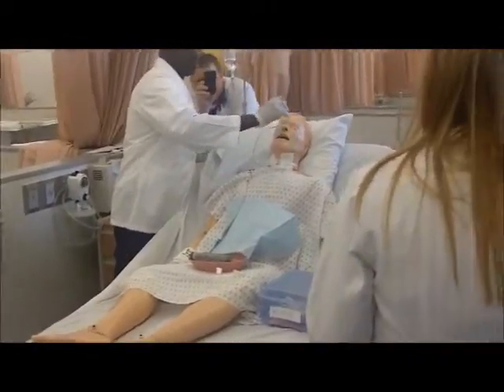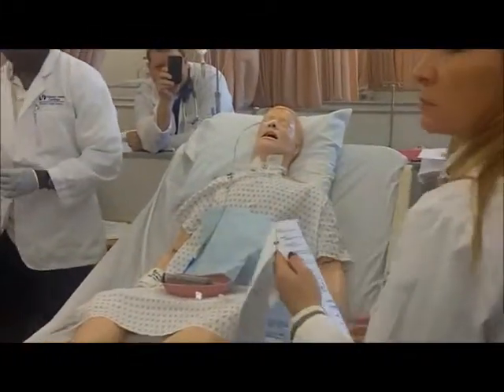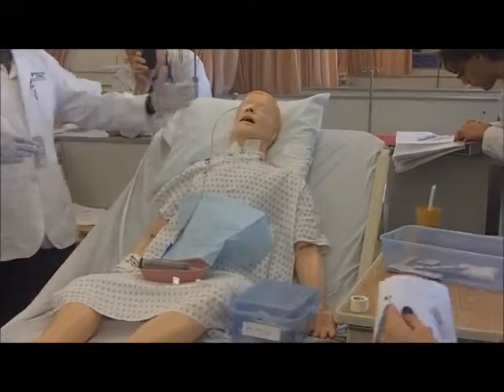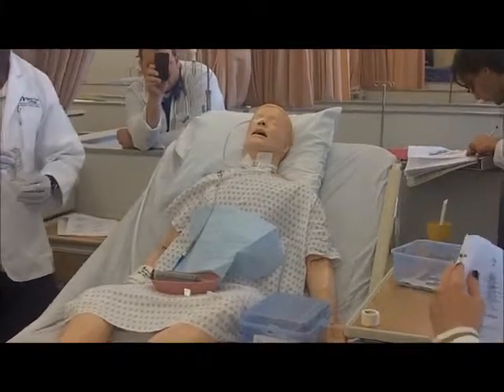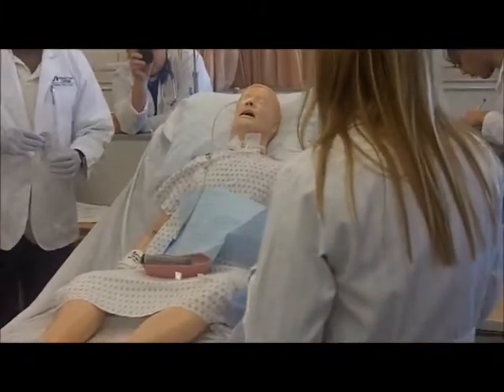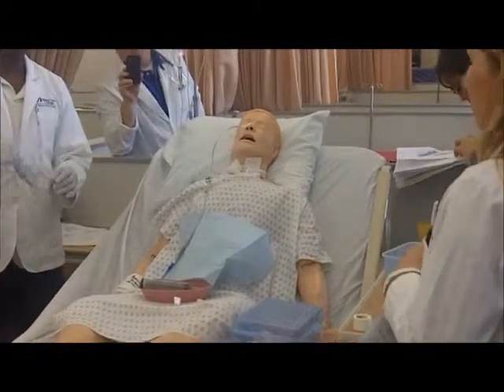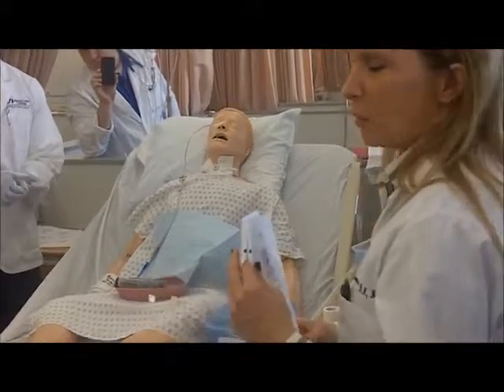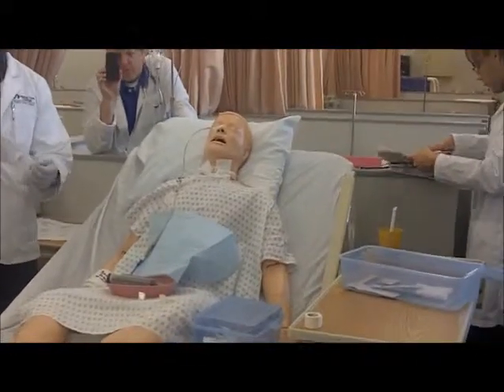Side rail back up, and bed down. And do they remain semi-Fowler's or at 30 degrees? 30 degrees. Is there a time frame for us to come back and check on the patient with the tube? You check placement. There's a couple of ways you can check placement. You can pull back gastric secretions. In your PowerPoint, I gave the different pHs of respiratory secretions, gastric, and something else. You can look at that.